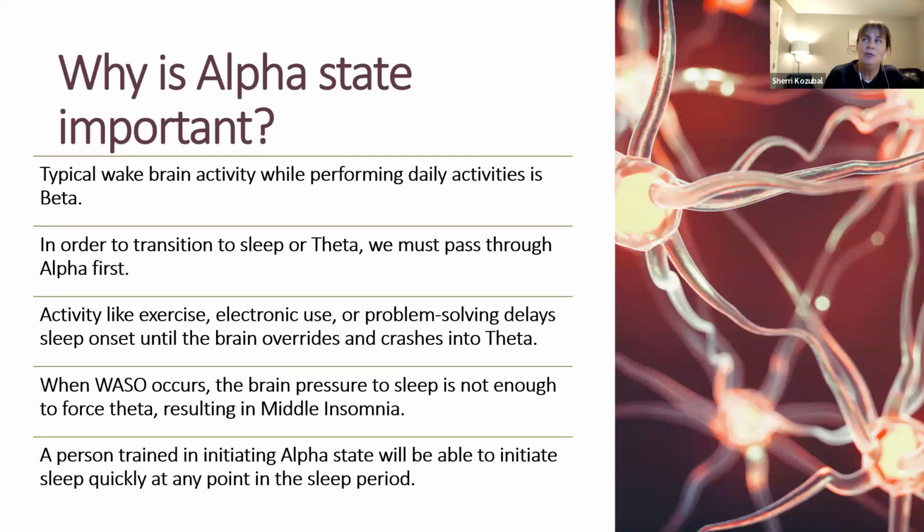Now, once you get that first 90 to 110 minutes, we have this wake after sleep onset time period that happens. We look at this in sleep studies and we see what the time of wake after sleep onset is. How long does it take for you to wake up again? And we look to see how many times you do that, how often you do it, and what happens there.